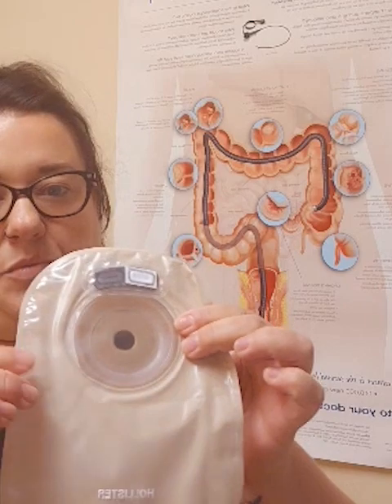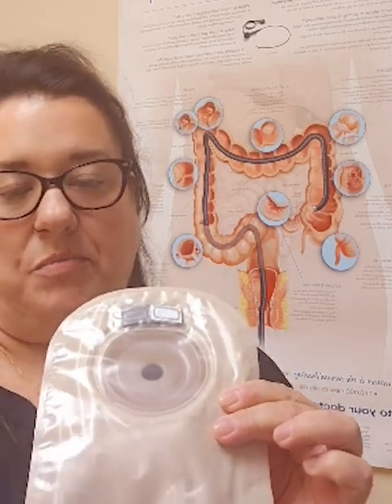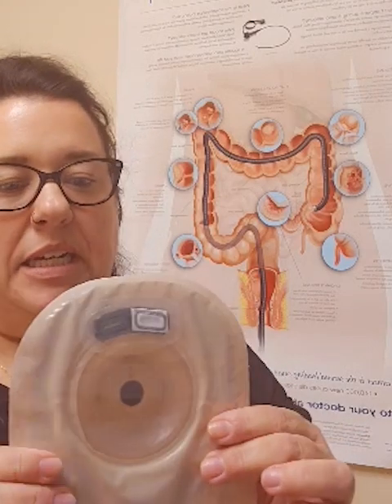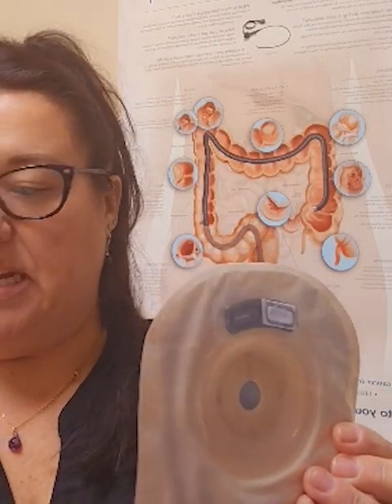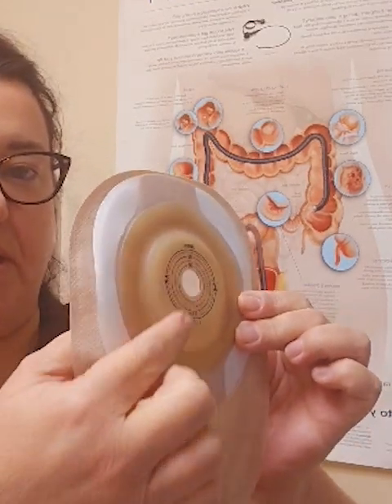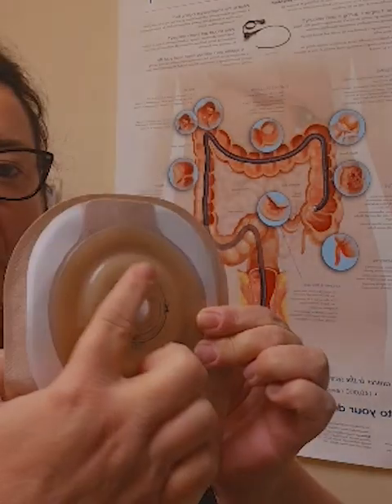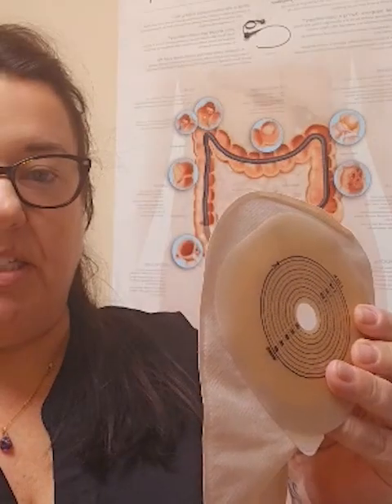When an ostomy is created, you would start to wear a pouch such as this one that would help catch the stool when it's excreted from the body. These appliances come in all different backings. They come as 2-piece, 1-piece. Some of them have a convex backing, which is what this is, with this extra ridge on it right here. Some are flat, such as this one.